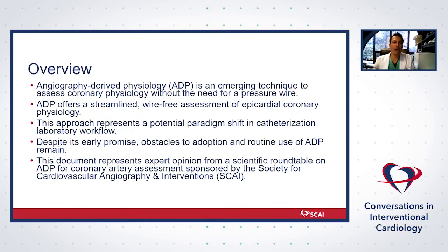So as some background, we know that angio-derived physiology, or ADP, is an emerging technique to assess coronary physiology without the need for a pressure wire. And this offers a streamlined, wire-free, drug-free assessment of epicardial coronary physiology. Now, the ADP approach can have a potential paradigm shift in cath lab workflow, but I think even more importantly, this can help to overcome a lot of the utilization issues that have existed to date with coronary physiology and help with more universal incorporation of using coronary physiology routinely in the cath lab.